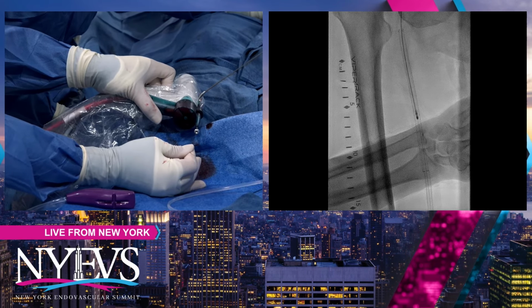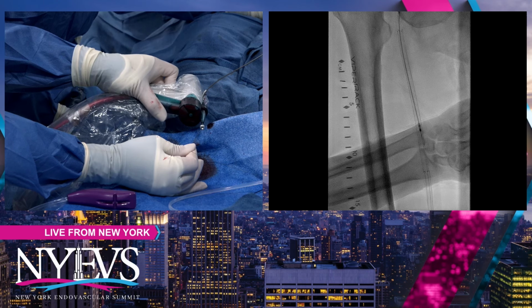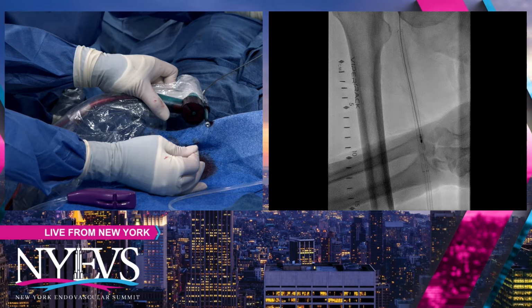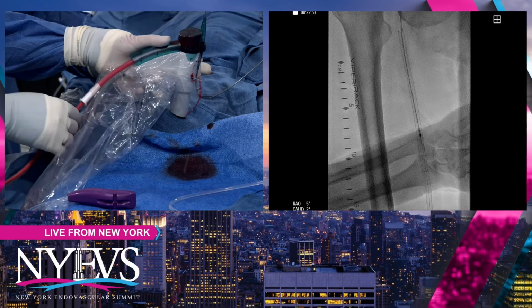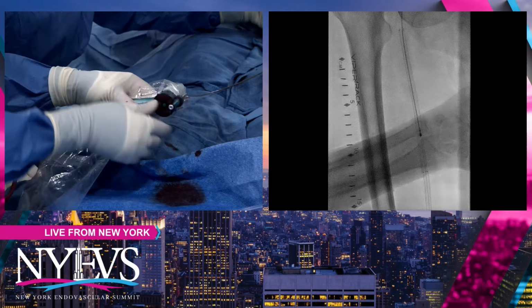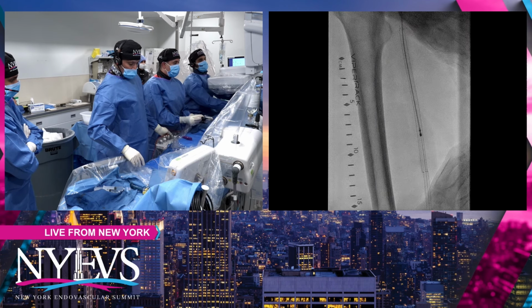Or is anyone thinking to reline it? There's data to reline it with covered stent. There are other options. Do you think about that ahead of time? To me, if you can clear out whatever's in there, clear it out, because whatever you leave behind is an impediment to full expansion of what you're doing. If you leave a lot of hyperplasia behind or even thrombus, then you may be inciting another problem. If you can debulk, because the curious thing is you're not going to expand the supera. But you want to get back to the wall-to-wall of the PTX or whatever the other stent is there as well.